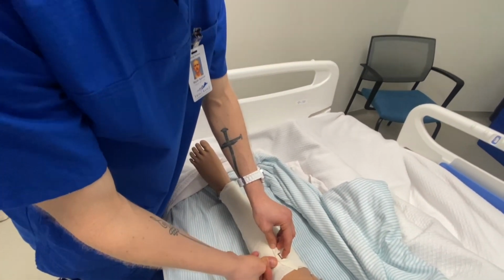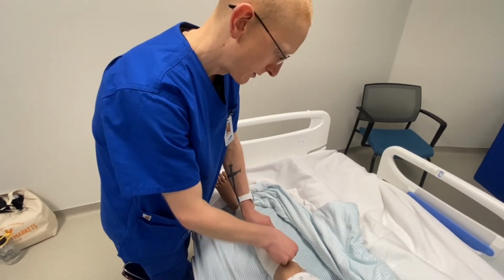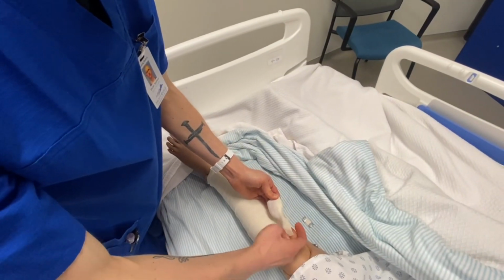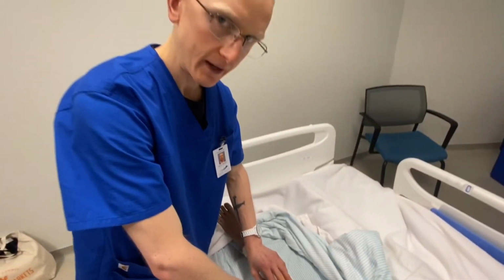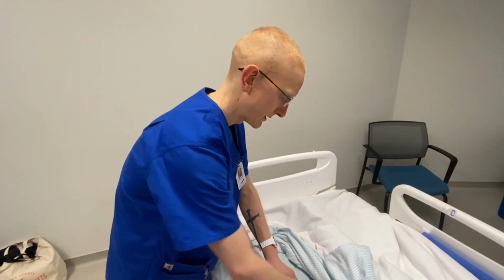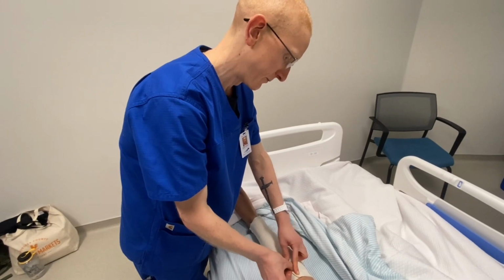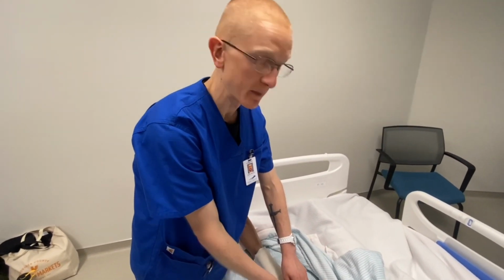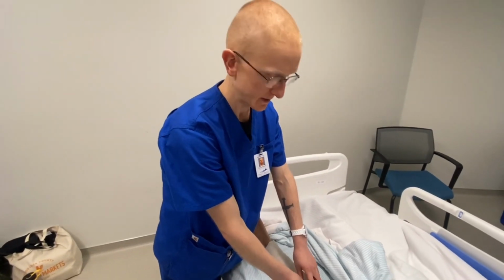There are other versions of the ACE bandage that have a Velcro strip on the ends of it, so you can just Velcro it, and that reduces the risk for injury to both you and the patient. A third alternative would be to use some sort of stretchy medical tape to be able to secure it into place.